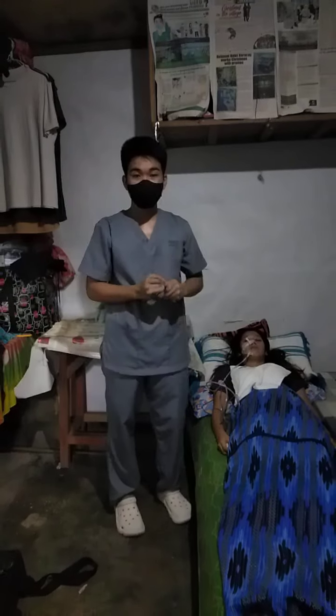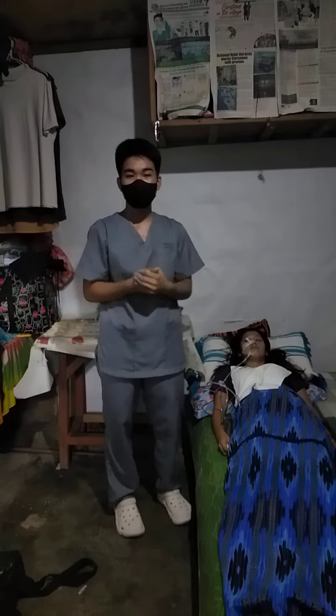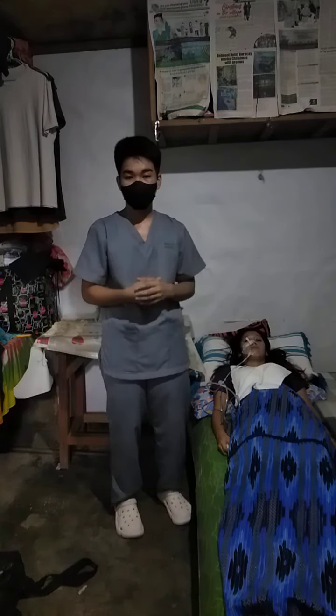Then cut a 4-inch piece of tape and split the bottom 2 inches, or use packaged nose tape for NG tubes. Then place it and split over the bridge of the patient's nose. Wrap the split ends under the tubing and up and over onto the nose. Be careful not to pull the tube tightly against the nose.